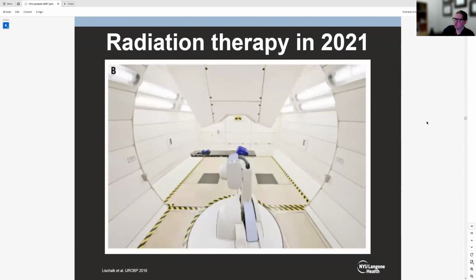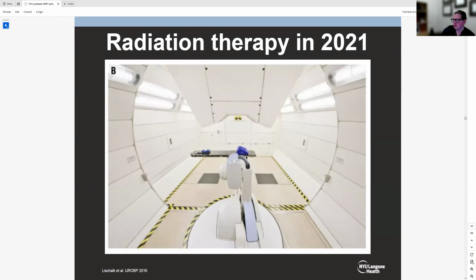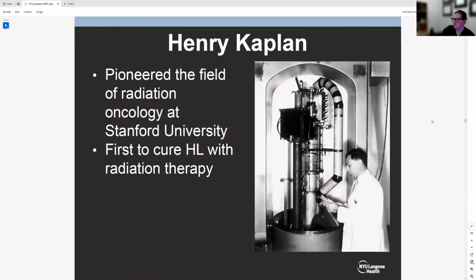And you fast forward over 100 years later, things have really come a long way. And this is a picture of an inside view of a radiation facility. Right here in the middle is that same bed that you saw in the prior photo. And this is really where a patient will lie down. And then this top of the picture here is where the radiation comes out of. The whole thing actually can rotate around the patient and come in from a variety of different angles. So you can see just from this picture how much change has happened over the last century.